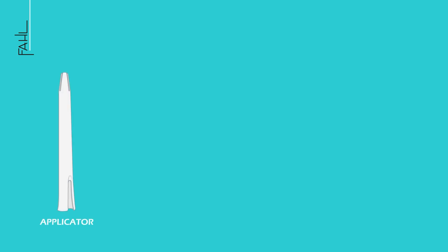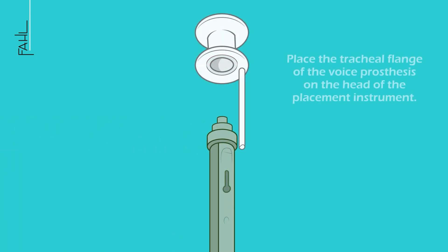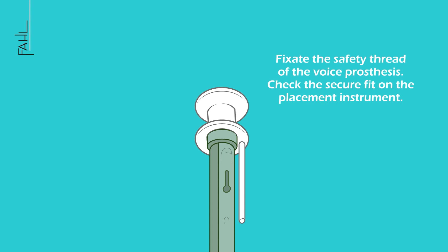Always use the original file products. First, place the tracheal flange of the voice prosthesis on the head of the placement instrument. Then fixate the safety thread of the voice prosthesis. Finally, check the secure fit of the placement instrument.